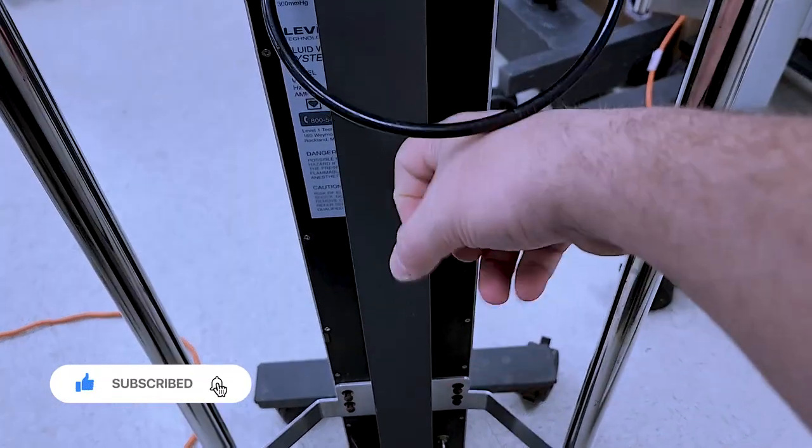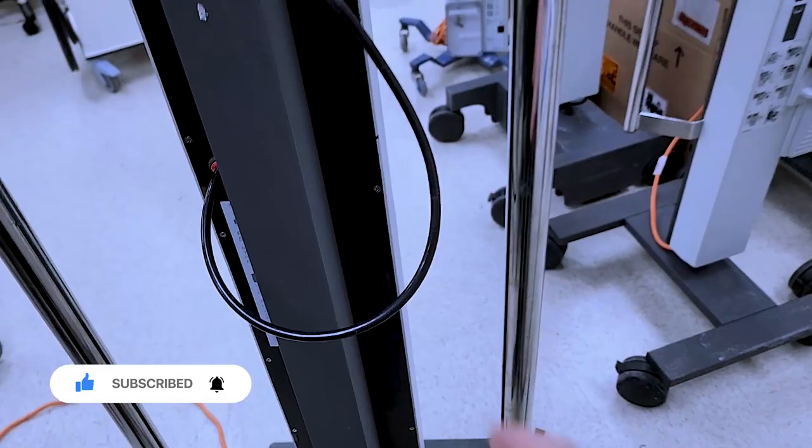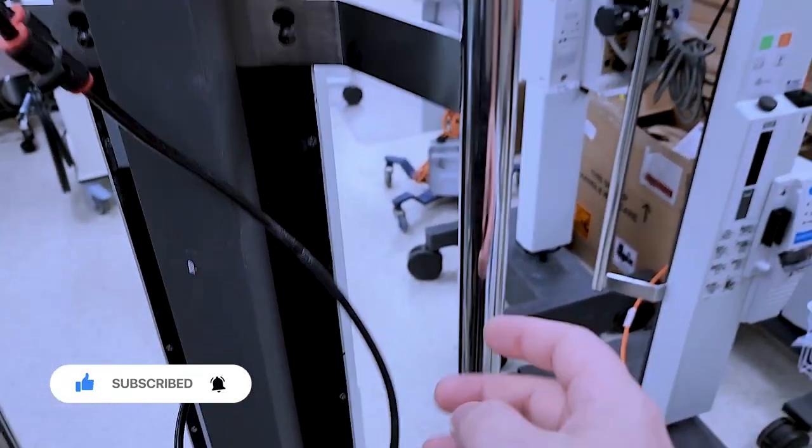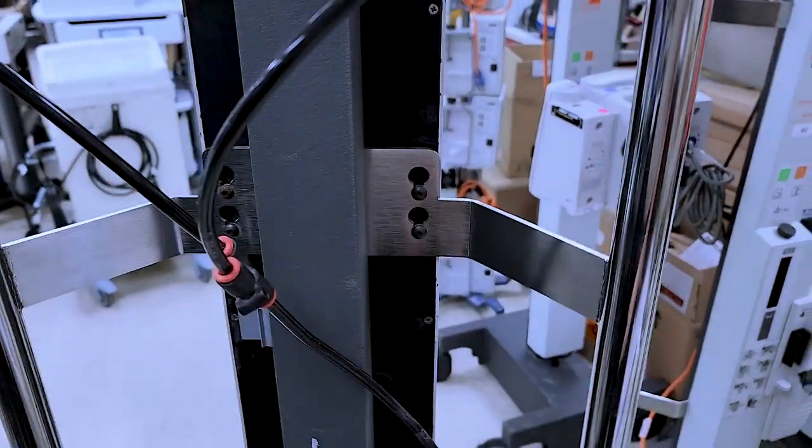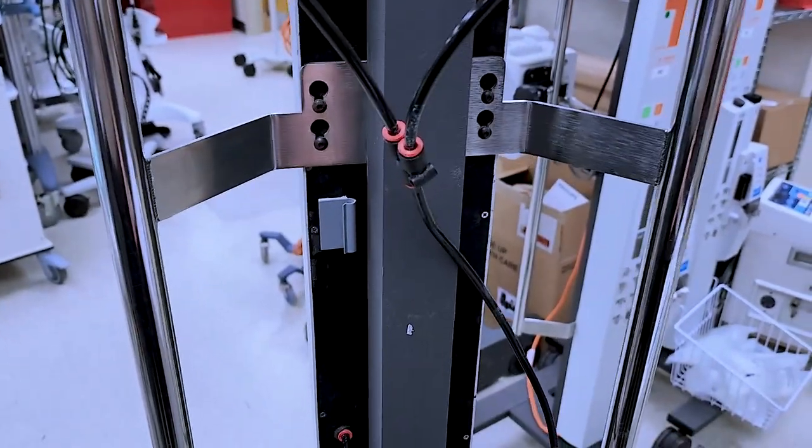And this is mounted to the pole. The base unit that we're taking off is mounted to this. Kind of simple. Alright, so let's go ahead and do it.